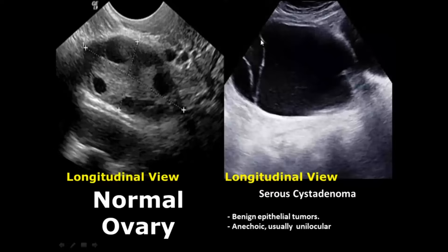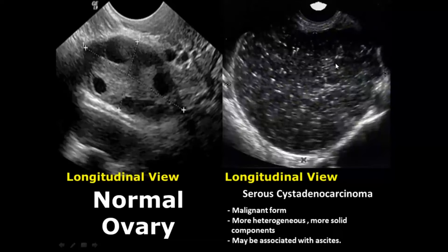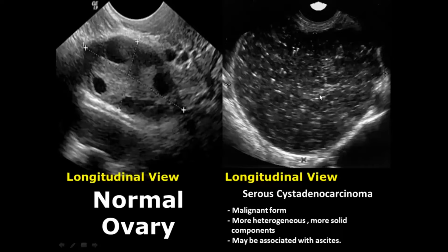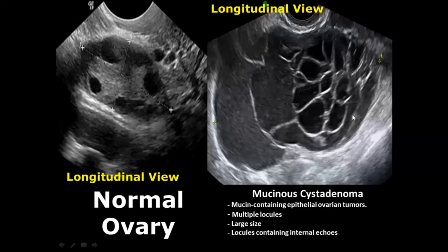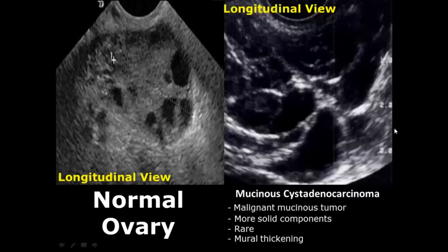Serous cystadenomas have anechoic, unilocular appearance — one compartment and anechoic, compared to the endometrioma. Serous cystadenocarcinoma is the malignant form, comprising heterogeneous appearance with more solid components, and the patient may also have ascites. Mucinous cystadenoma is larger in size and has many locules. Mucinous cystadenocarcinoma is the malignant form with more solid and heterogeneous components, and the walls of the locules are more hyperechoic.